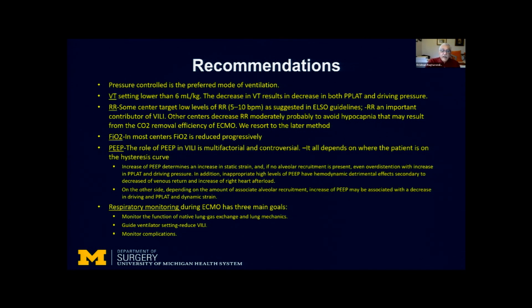We also guide our ventilator settings, and as I said numerous times during the talk, the general idea is to reduce ventilator-induced lung injury and promote lung recovery. And obviously, we look for monitoring of complications. Typically, we'll get a blood gas 3 times a day, a chest X-ray once a day in the morning. We also monitor these patients for free hemoglobin, as well as evaluation of the circuit, which is performed at least 4 or 5 times a day by ECMO specialists. By and large, in our ICUs, ECMO patients are taken care of by just nurses, and the ECMO specialists are available in case there are any problems.